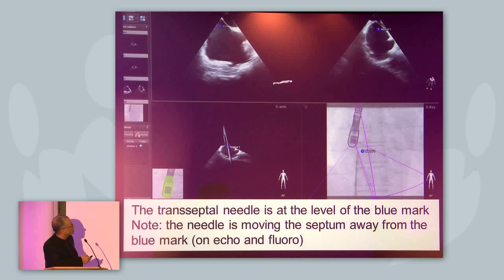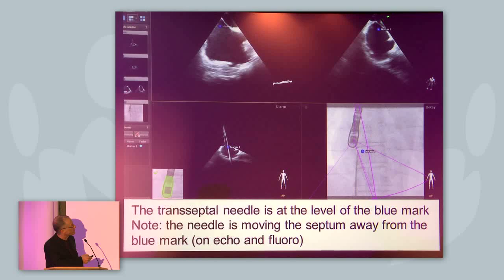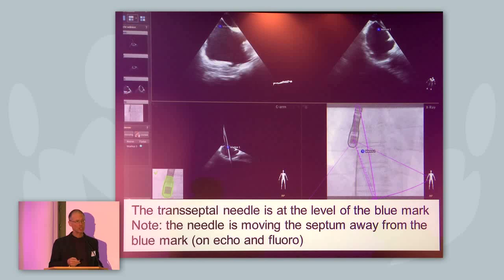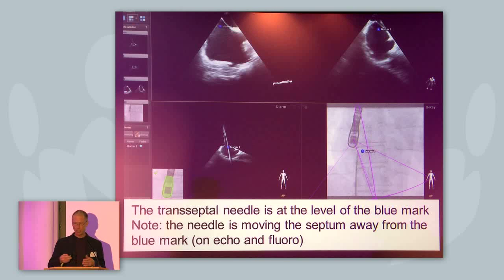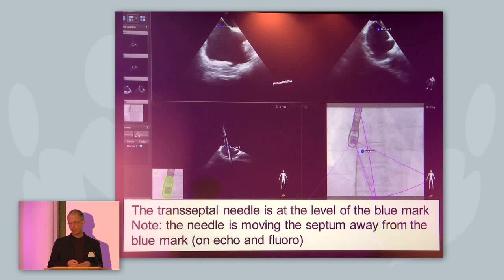Note that you can see the soft tissue has moved because the needle is pushing the septum towards the left atrium. That means the mark is not anymore at the original position, and you can see this on both echo and fluoro. So this is one of the limitations: if the soft structure is moving or changing position during the procedure, then the marks are obviously not reliable anymore.